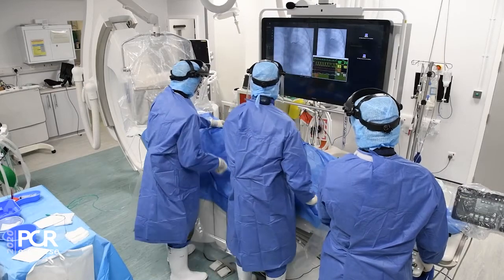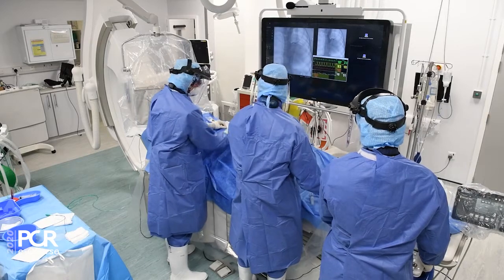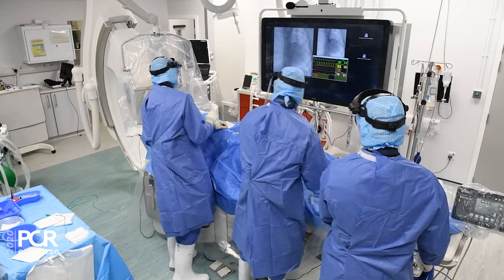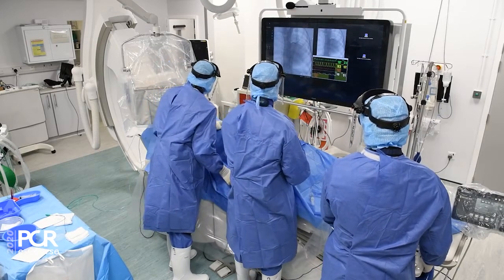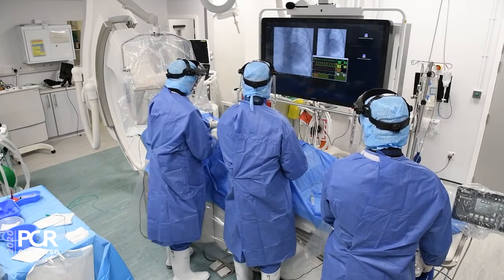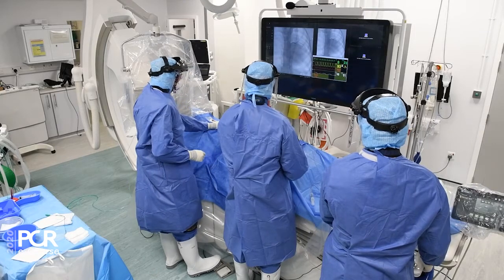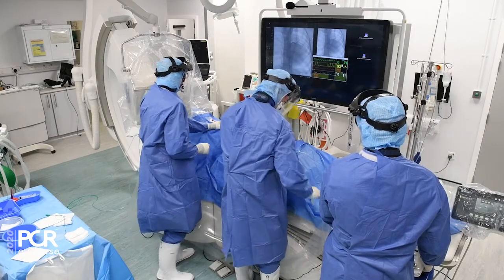My God, he's in trouble, this guy. Okay, fine, fantastic. So let's just leave that wiring, get the BMW ready. Okay, are the pads definitely on? This guy's in trouble. Okay, fantastic. Okay, so let's watch that rhythm. Okay, good. Let's carry on with the wire. Yeah, wire's here, sir.